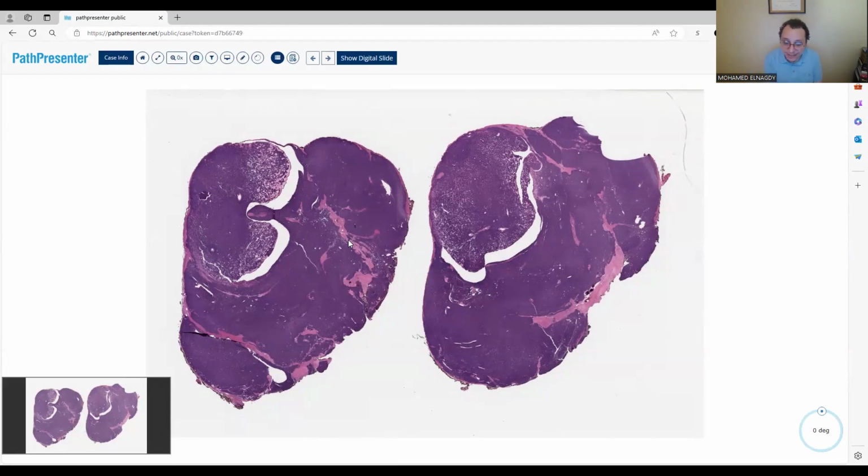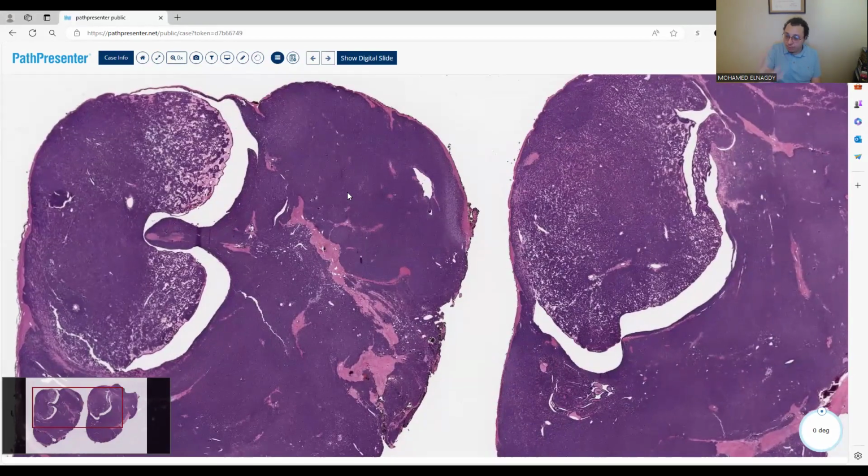But why are you saying BRAF? Because what do you see here? Blue. So this is blue, okay, but even without looking at it, among the tumors we got, the only mutation that's noticeable was BRAF, so it should be that one. But it could be VHL. Well, not the blue though. Yeah, but it's the only blue tumor which had a characteristic mutation. Is it deep blue or just light blue? This is deep blue.